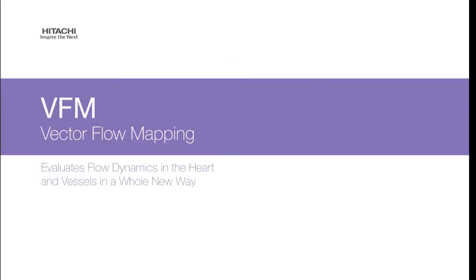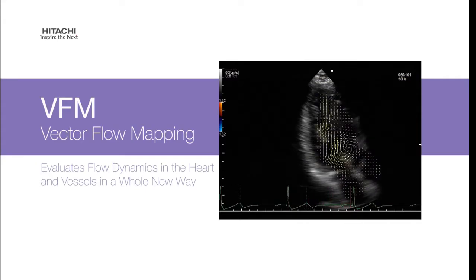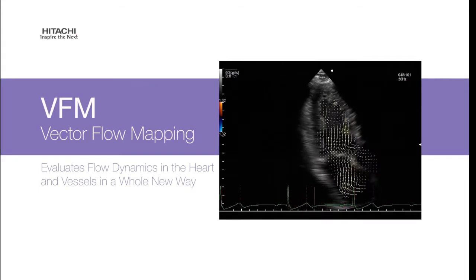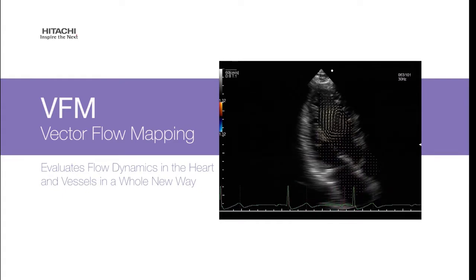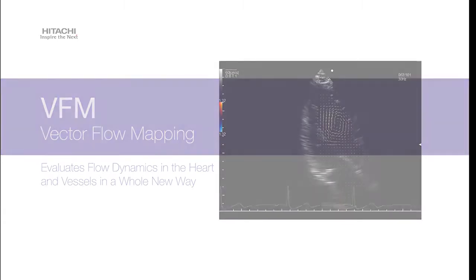Vector flow mapping, known as VFM, demonstrates flow dynamics in the heart and vessels in a whole new way. Evaluating pre- and post-surgical ventricular and transvalvular blood flow, cardiomyopathies, along with LVAD compliance, are just some of the ways VFM may help you assess complicated hemodynamics and determine surgical strategies.